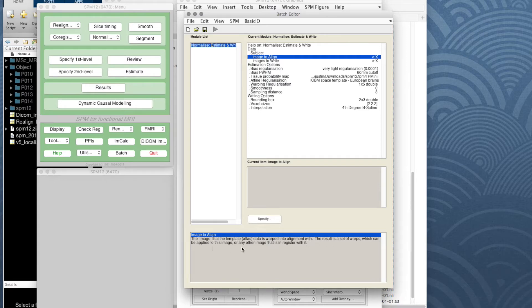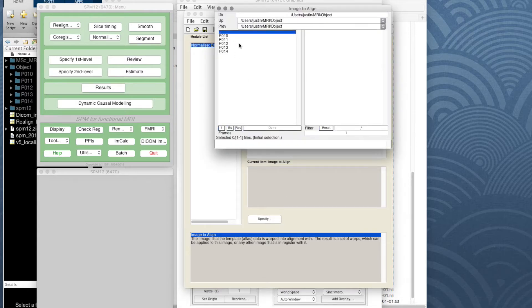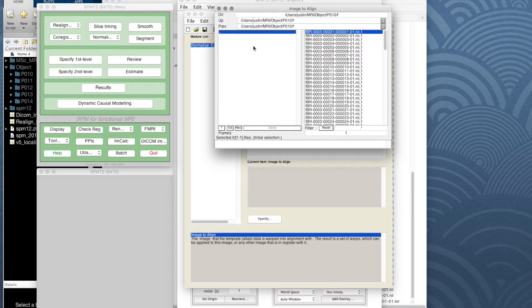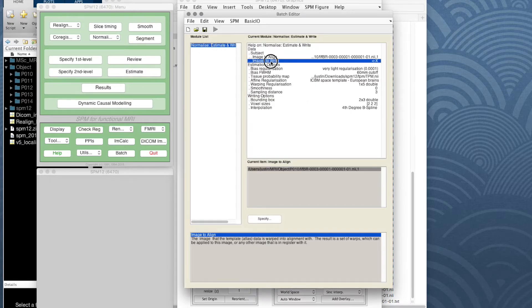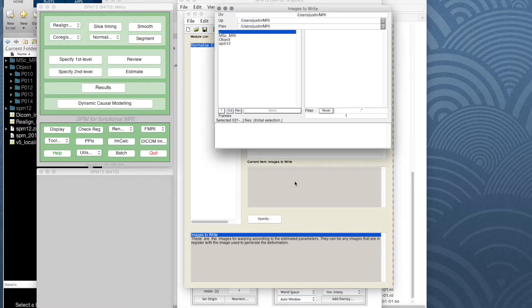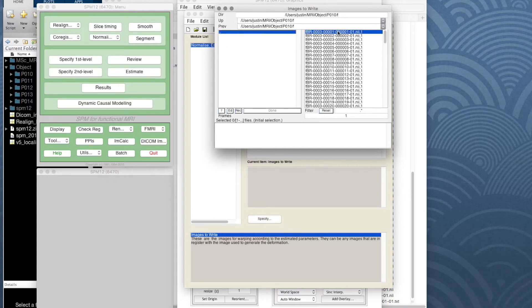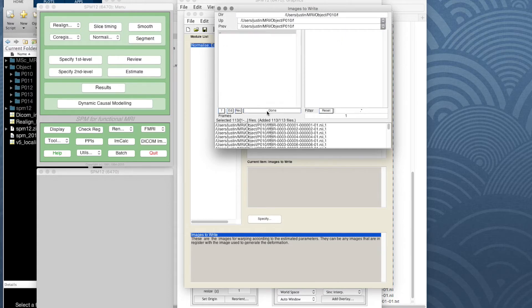Those warps can be applied to this image or any other image that's registered with it. Since all our functional images are now lined up, we can use any one of them, but we'll typically just use the first one. We'll do this for participant 10 first, selecting that first functional image. For 'images to write,' that's the whole functional sequence, so we specify participant 10's functional sequence — right-click, select all — that puts in 113 images.